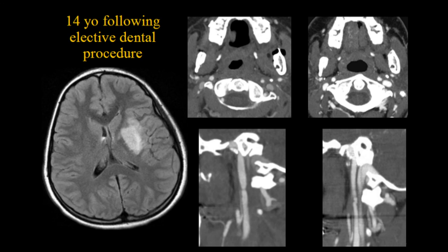But again, just to reiterate the benefits of CTA, we avoided doing the angiogram in this patient, and she was able to be followed completely with just CTA alone.